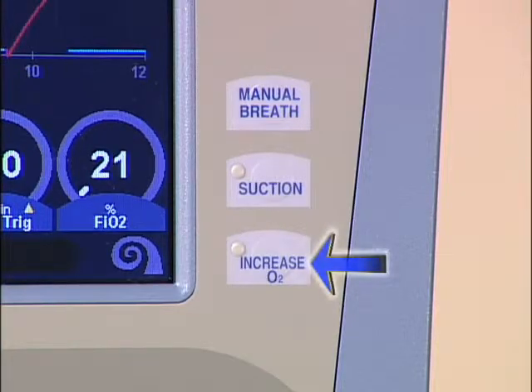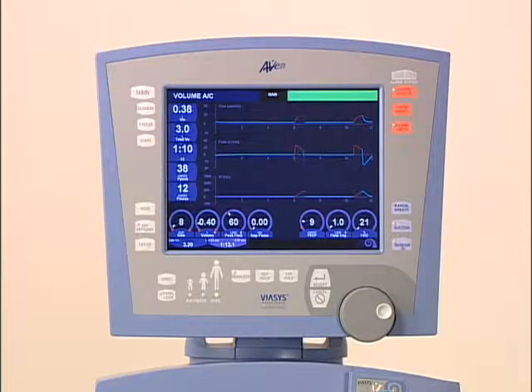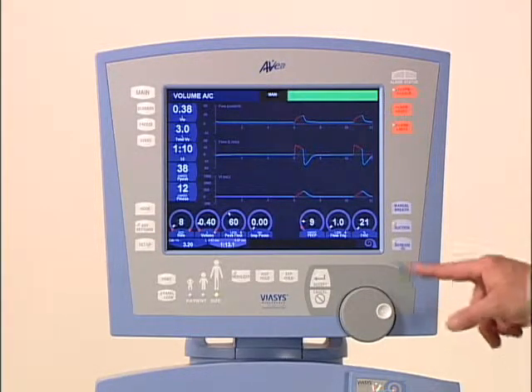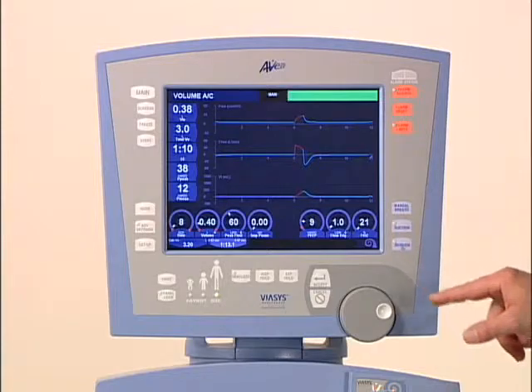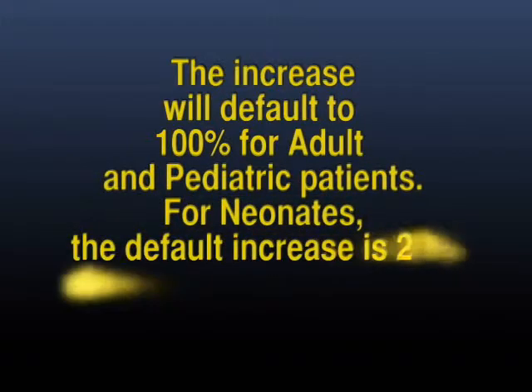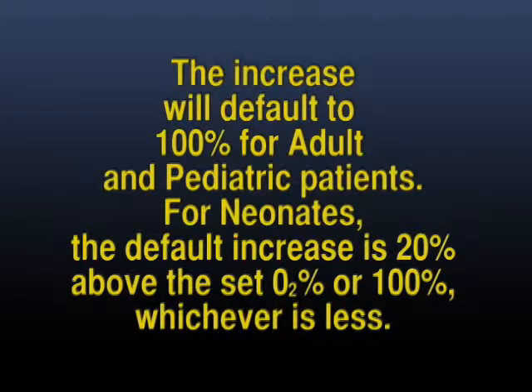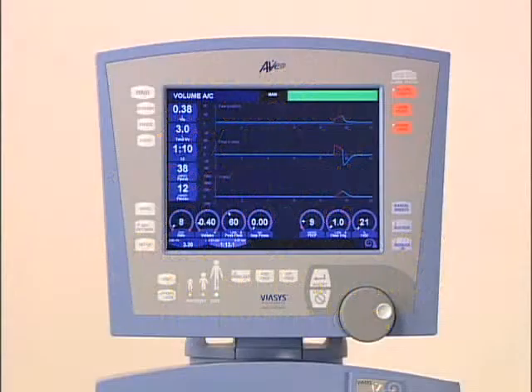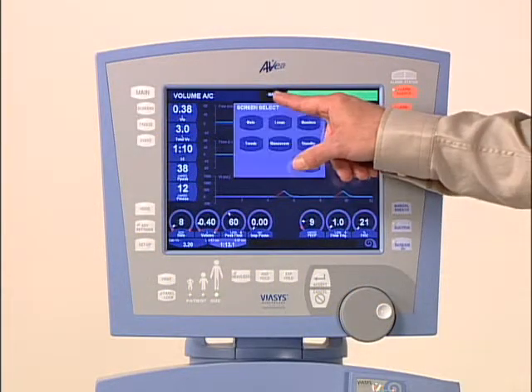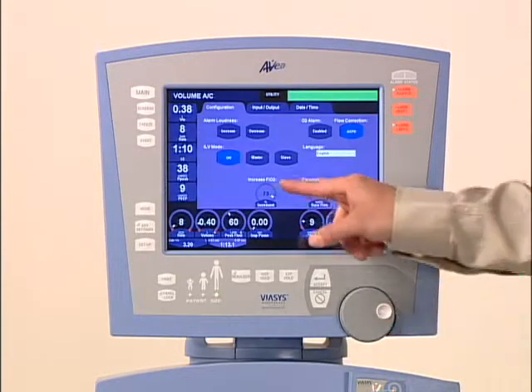The increase O2 button is used to increase the concentration of oxygen delivered to the patient for 2 minutes. Pressing the button a second time before the 2 minutes has elapsed returns the FiO2 to the prior setting. The increase will default to 100% for adult and pediatric patients. For neonates, the default increase is 20% above the set O2 percentage, or 100%, whichever is less. The clinician is able to configure this control by accessing the utility screen and selecting any desired increase in delivered FiO2.